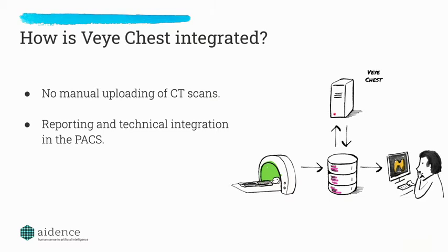They don't have to log on to a different workstation or have separate passwords, and it also provides the ability for flexible working. Obviously there are also the teleradiology companies where people can work remotely. Also some hospitals have the ability that some of their radiologists can work from home. So if they've got the setup at home to be able to view their PACS and their RIS systems and report scans, they can also report scans with Veye Chest.